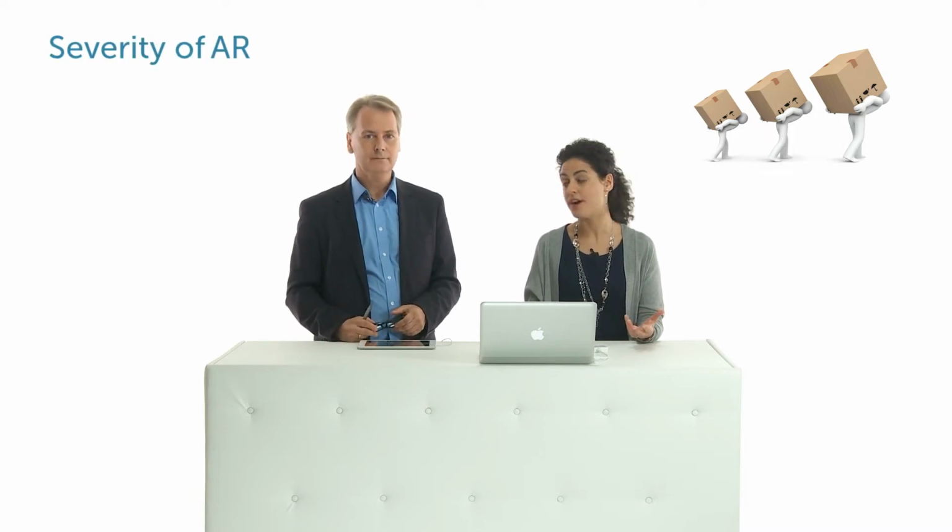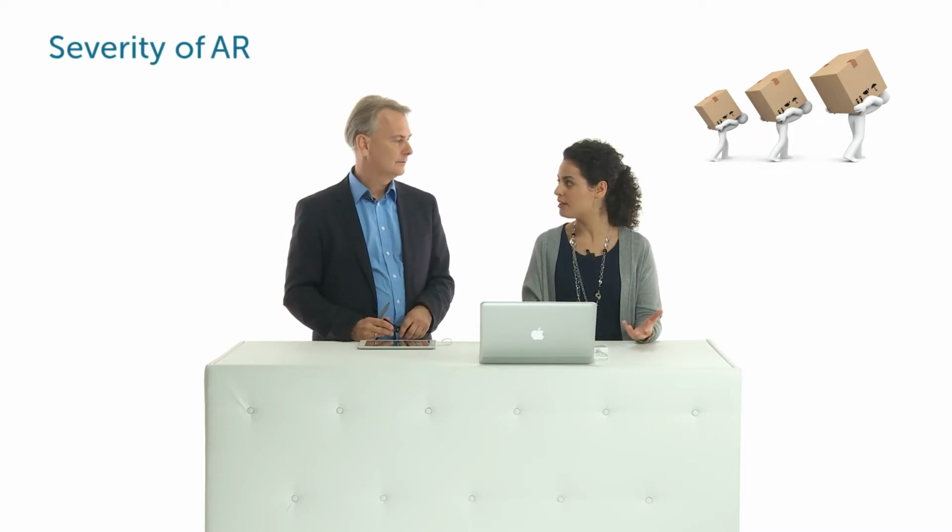And now that we know the possible causes of AR, it's important to assess the severity of the disease. And do you think it's difficult, easy to assess it? Well, I think it's more difficult to assess AR than MR. One reason is that it's probably difficult to see the proximal portion of the jet because it's kind of behind the aortic valve. But if you get a lot of practice and see many examples, it will be easy. And especially if you take the recommendations that we gave you at the beginning of the chapter, for example, scrolling back and forth and playing the videos in slow motion.